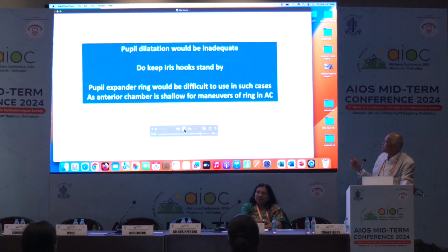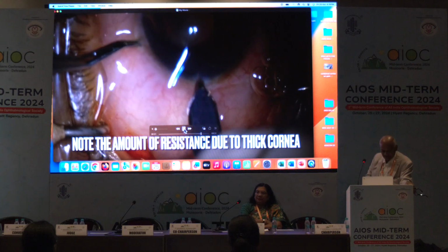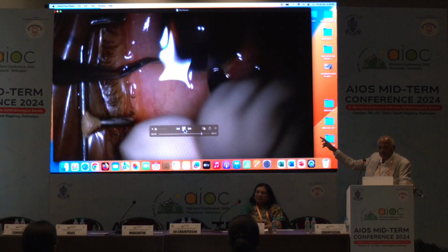Now see, I am doing it. Here the pupil is not dilated adequately. Secondly, the cornea is thick. See here, I am going in, the cornea is thick.